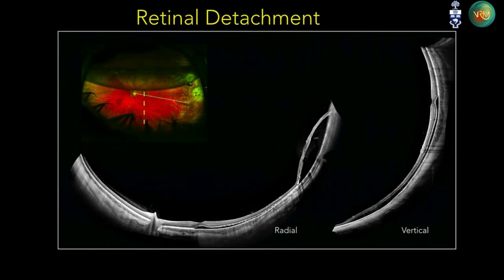So what about surgical cases? This is a patient with a retinal detachment that had a pneumatic retinopexy in our office. As I mentioned, gas is no longer a barrier, and we have long line scans that the device can take. So you can actually get information about how well your pneumatic is doing or your detachment patient. Is the fluid resolving? Is there a new break? Is the break covered properly? Do I need to do anything else additionally surgically?